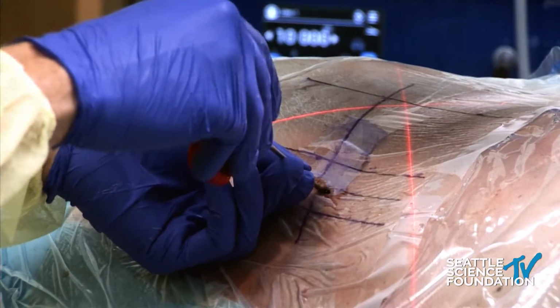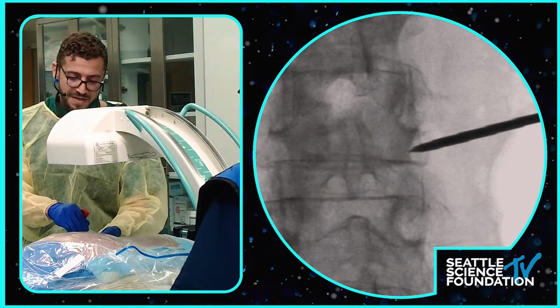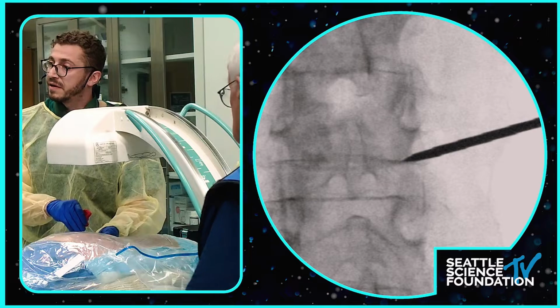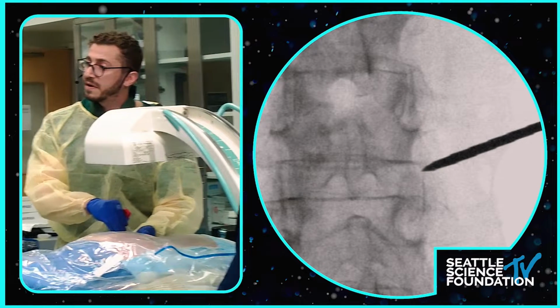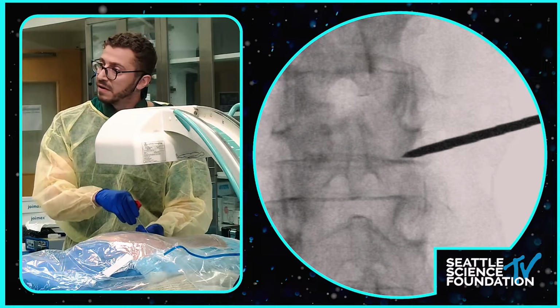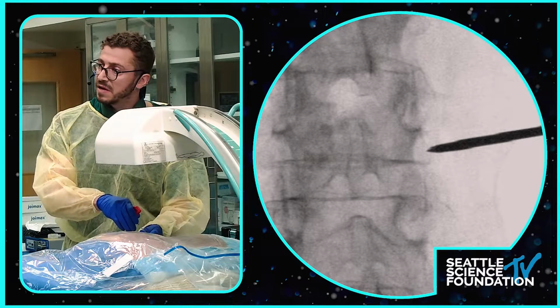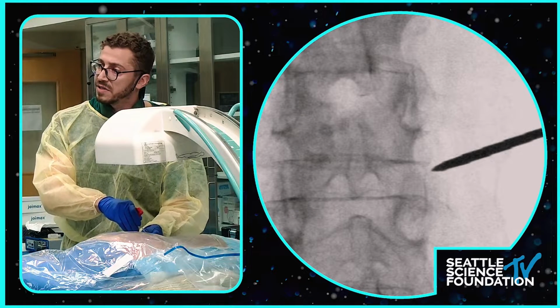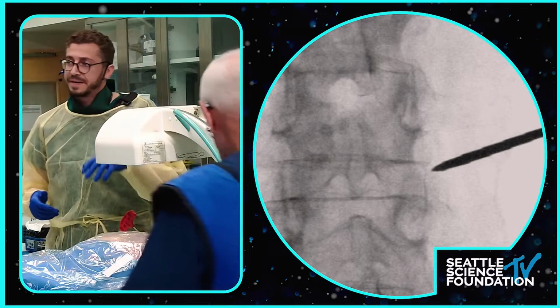So I just take an AP. I guess I may be a little bit high there. AP. AP. AP. Okay, so let's see. This looks like it's still a little bit high. Let's see. AP. Okay, so that might be a good spot there. I feel like I'm on bone here. So if you can do a lateral, please, that would be great.